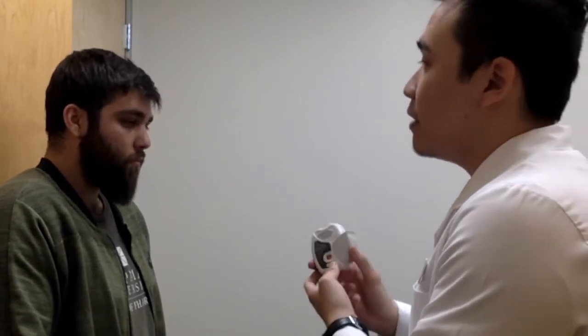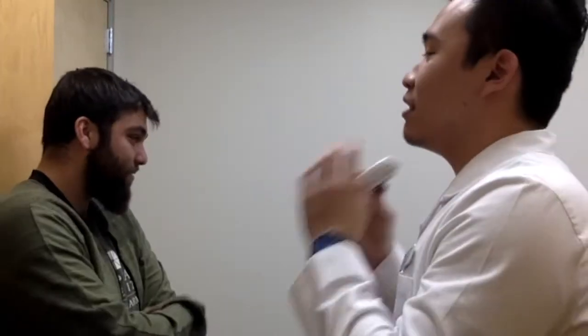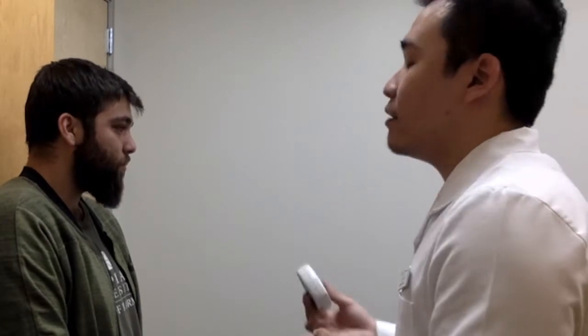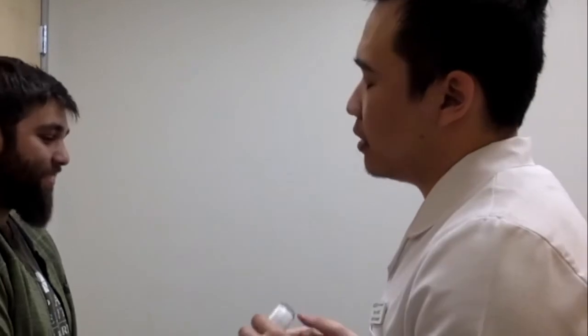And then your inhaler is now ready to use. While holding the inhaler away from your mouth, breathe out fully. Do not breathe into the mouthpiece and do not put your hand over the air vent. Take a long, steady, deep breath in through your mouth and do not breathe in through your nose. Remove the inhaler from your mouth and hold your breath for about 3 to 4 seconds or whatever is comfortable for you. You breathe out slowly and gently, and you may not taste or feel the medicine even if you're using the medicine correctly. Is this clear?